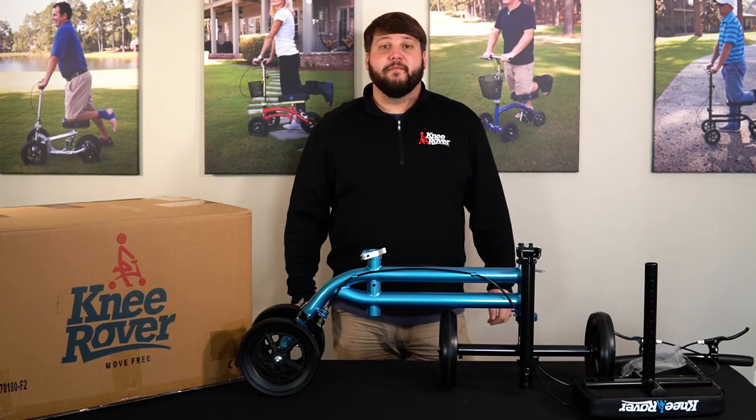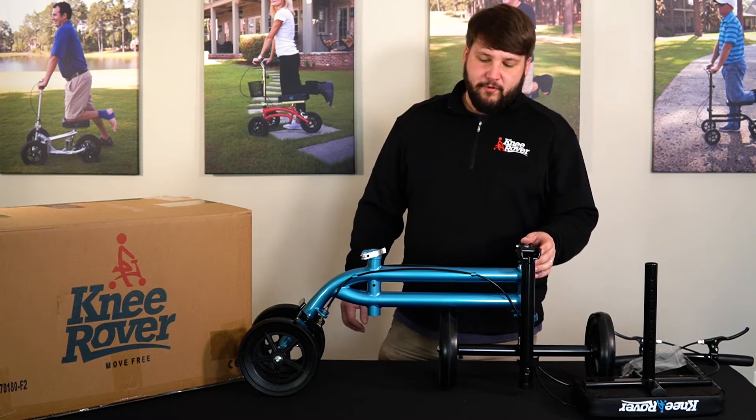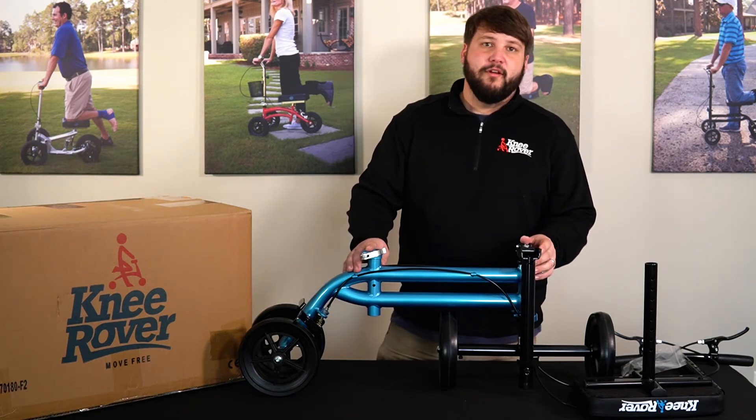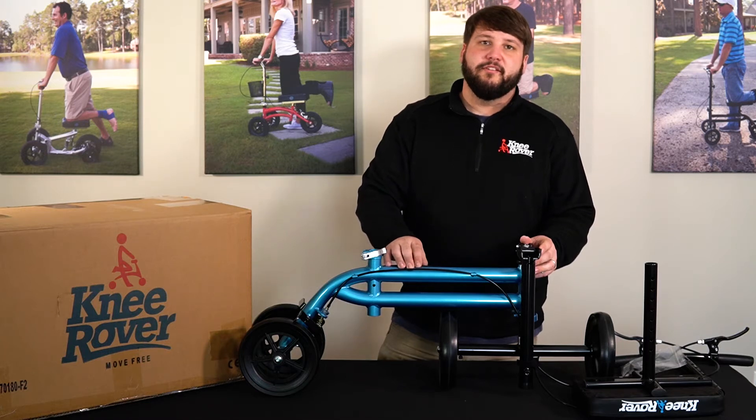Hey, Justin from KneeRover.com and today we're going to assemble your Economy Knee Scooter. This will work with the black Economy Scooter or the blue Economy Scooter — it's going to be the same assembly, just different colors.